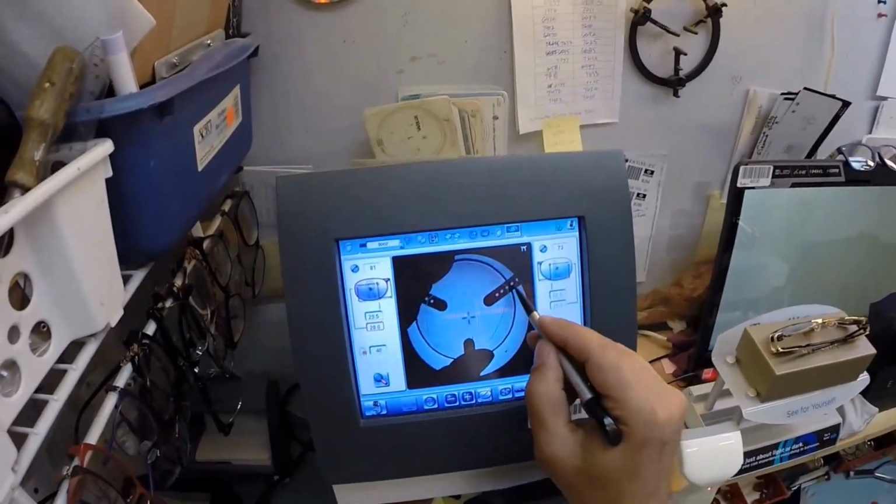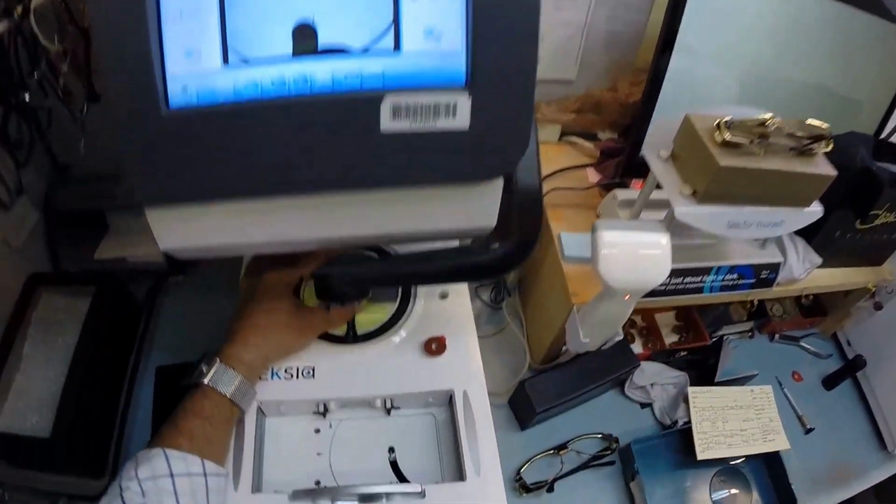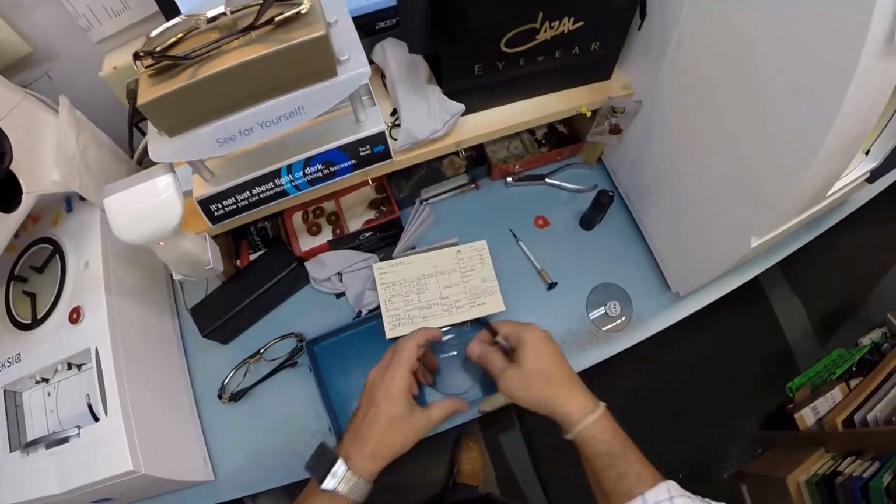I just want to check one thing. Oh yeah, this is going to cut out. That's in there perfectly, so I'm going to hit that button. The arm's going to come down and place the block onto the right lens. I'm going to set that there. Let me pick up your left lens.